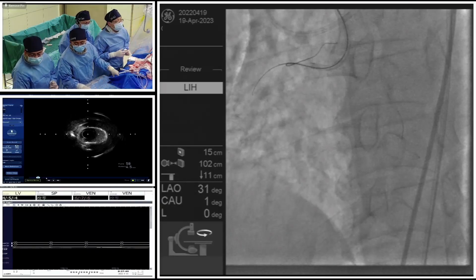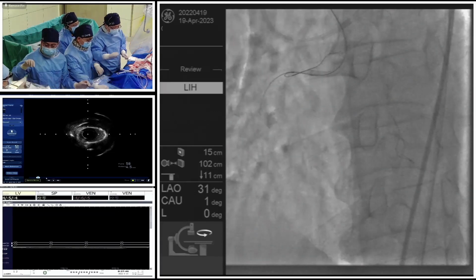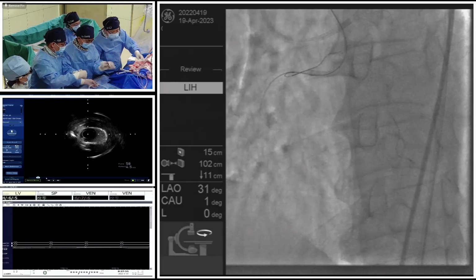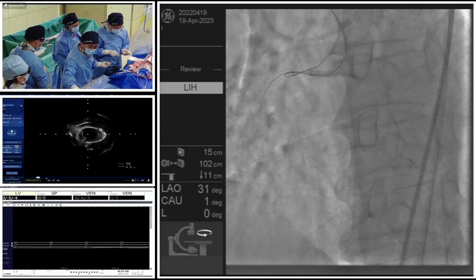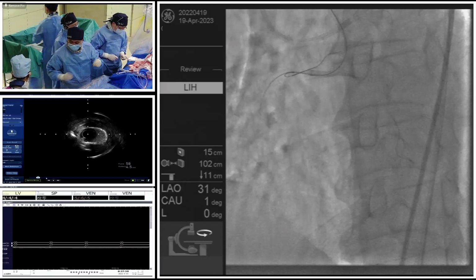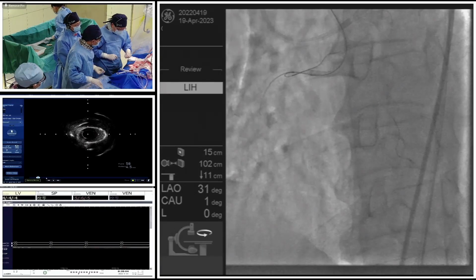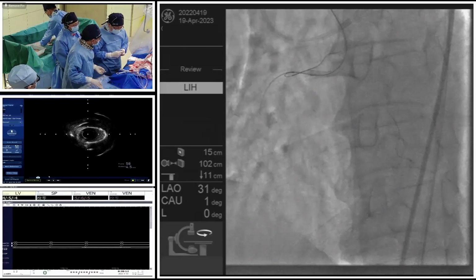For this case, based on the CT angiography imaging, if the antegrade wire could come into the distal true lumen, the wire must be stiffer than the plaque. Theoretically, yes. Theoretically, the second wire should be stiffer and the curve should be a little bit larger than the first one, to choose the right direction.